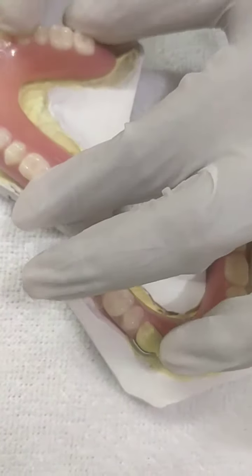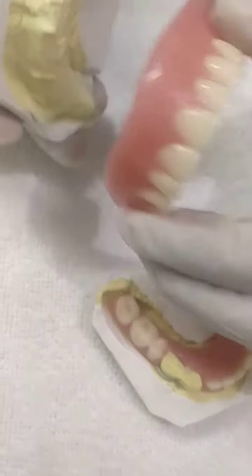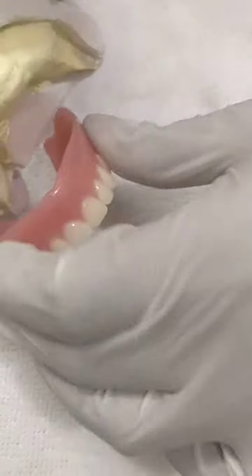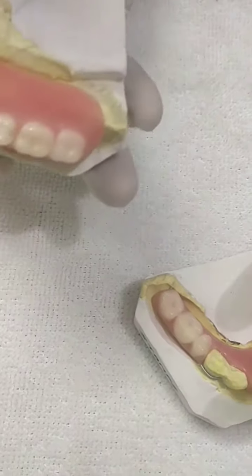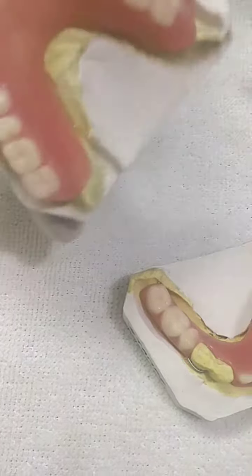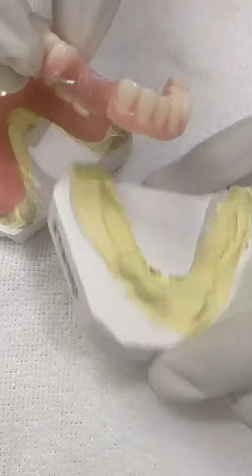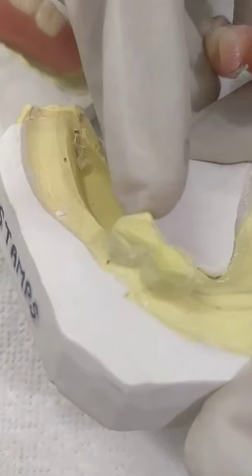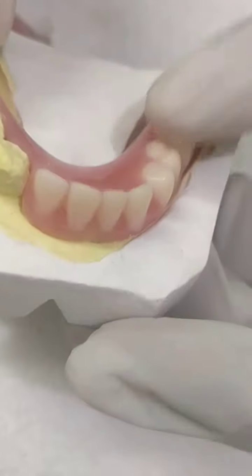See the seating and the fitting — it is having a good seating and a good fitting. Now see the fitting, and in the lower one you can see I have added a clasp here to engage this canine.